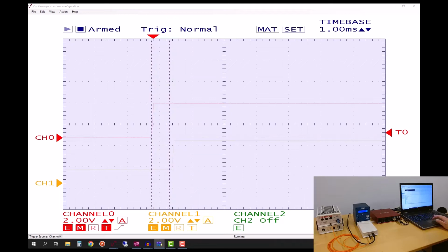Let's just play it again. So part of this is because the sound device that I'm using, this Focusrite, is interfaced to presentation over USB. There's some buffering that's happening in order to get data to the sound device. But also the trigger device that I'm using is a USB mediated trigger cable. It's pretty accurate, the Biosemi trigger cable. But here we're looking at jitter and delays.